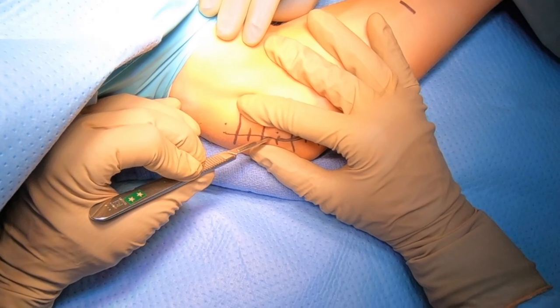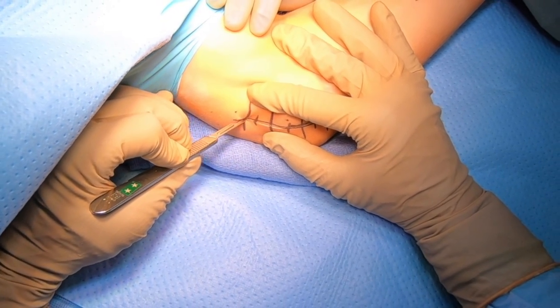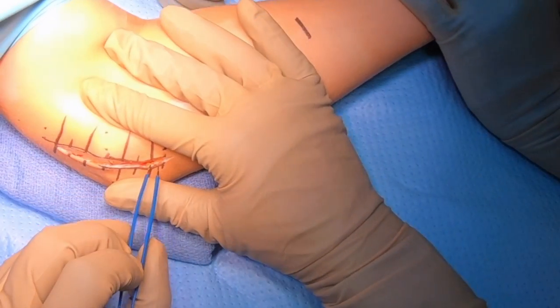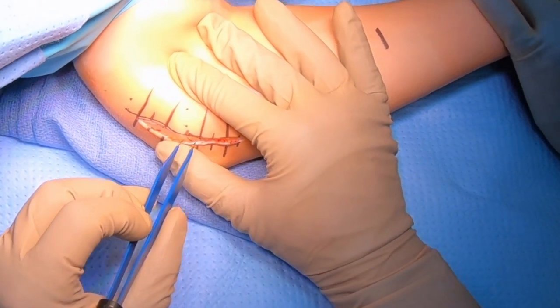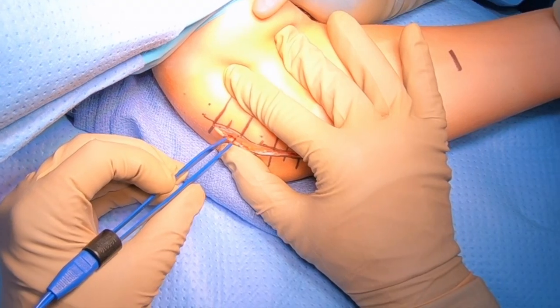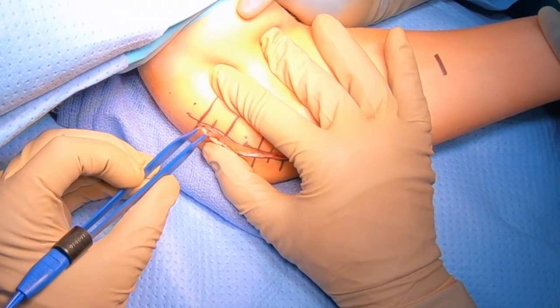Once we've made our incision through the skin, we'll make sure that all the small blood vessels on the backside of the skin are perfectly coagulated. We're using what's called a bipolar electrocautery here to make sure that no energy travels anywhere but between the two tines of the forceps.